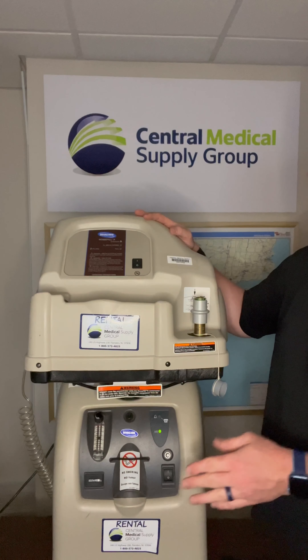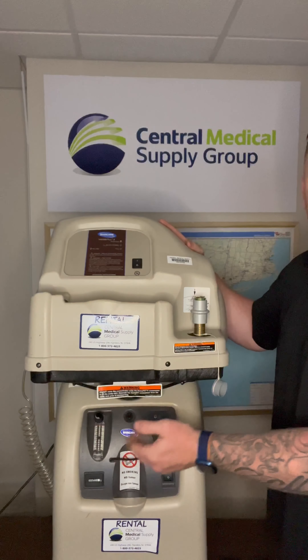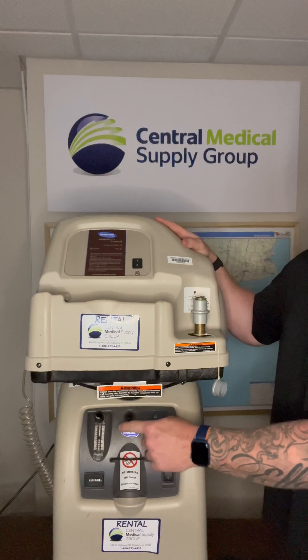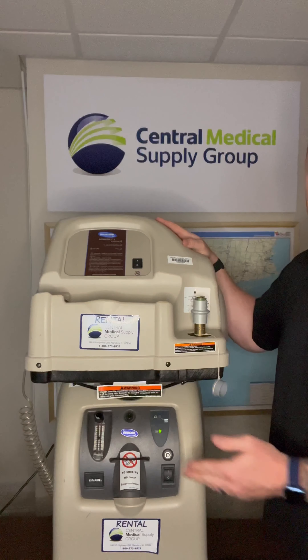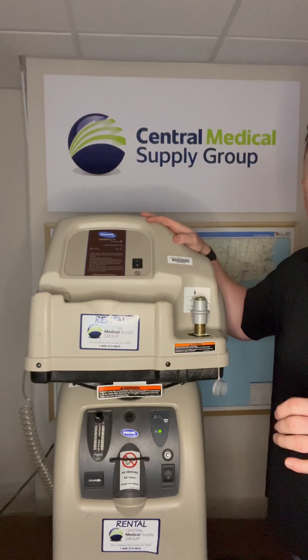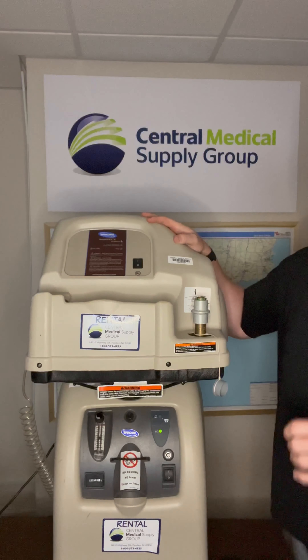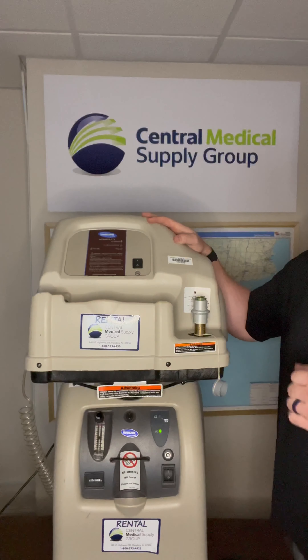Using the adjustment knob, ensure that the flow rate on the concentrator is at or below three liters per minute. A small black or orange ball in a clear plastic cylinder on the front of the machine indicates the flow rate from zero up to five in half liter increments — not above the line, not below it, right on the center of the line. Allow the concentrator to run for a minimum of five minutes.